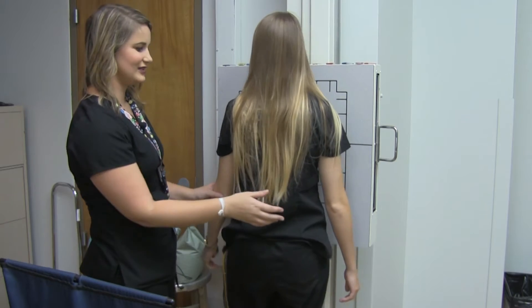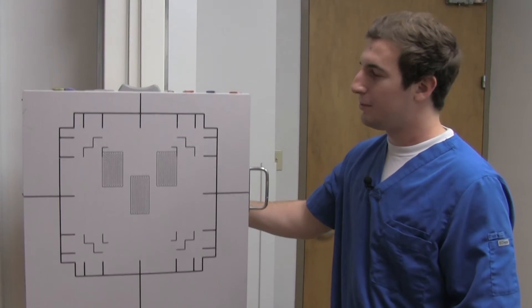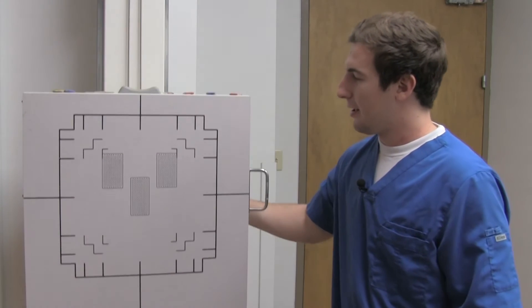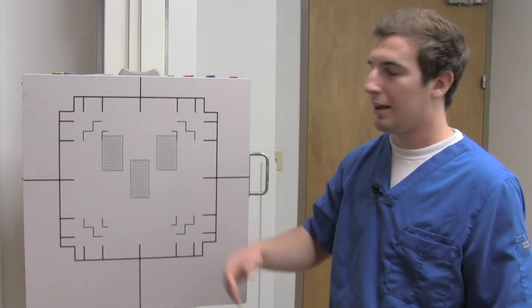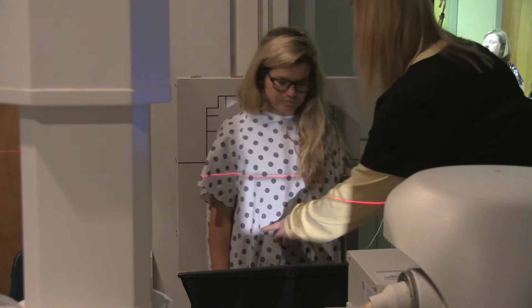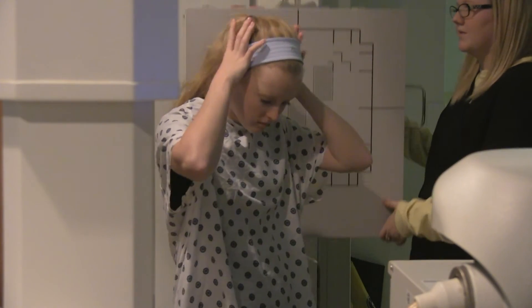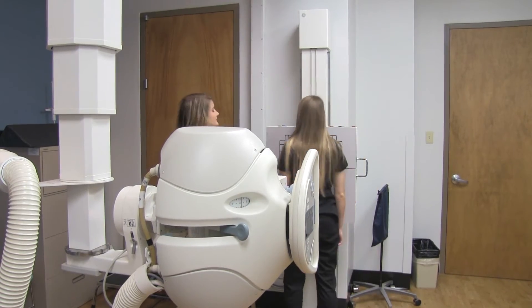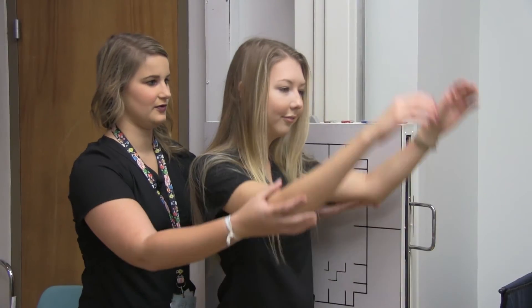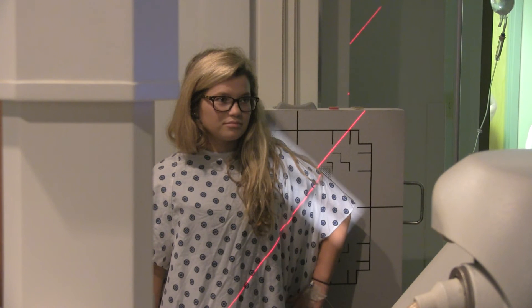This is our wall bucky that we'll use for upright x-rays. It's adjustable by height and it also has photo cells that help get the right exposure for our images. We'll use the upright chest board to acquire images to demonstrate air fluid levels as well as weight bearing projections for extremity work.